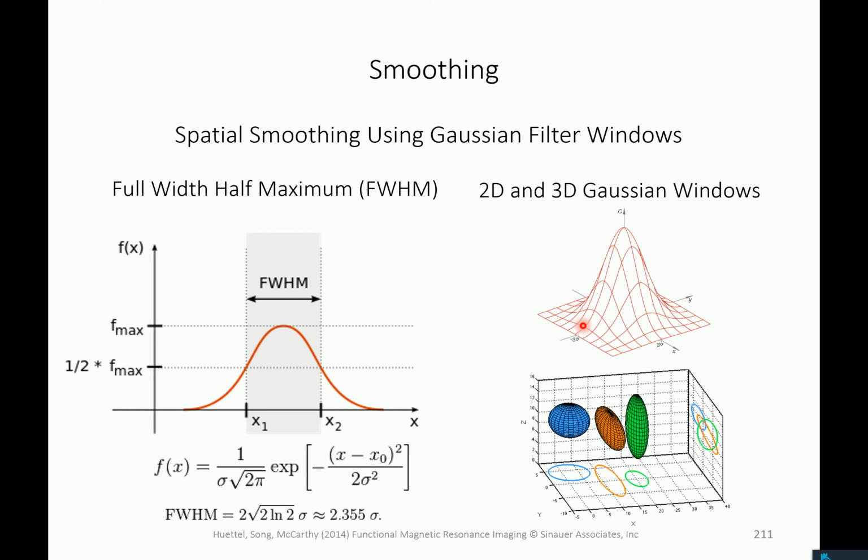I just wanted to check if that's true, and that they assume that the noise is randomly distributed over the brain, but the signal is not. If you want to measure activation, the signal, of course, is not random. So what I was thinking is that this is a distribution to apply a kernel to even out all the noise.